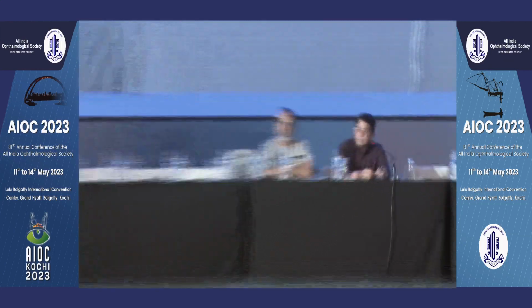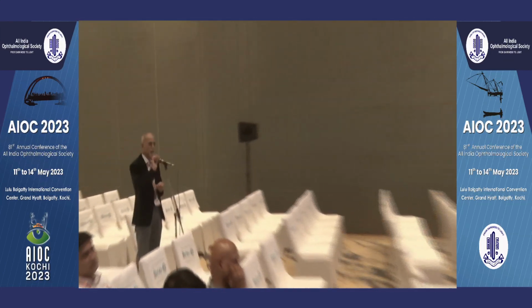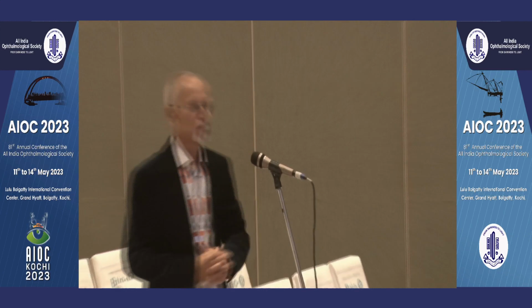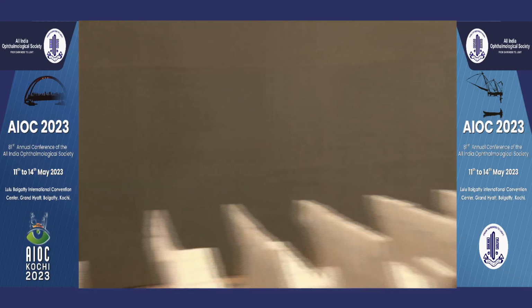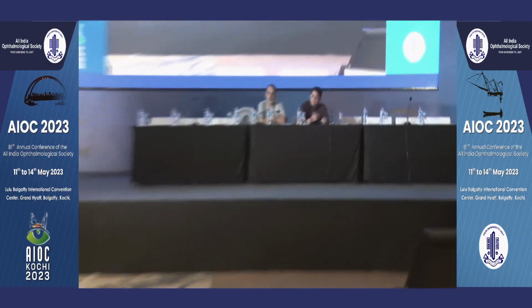Dr. Ramurthy, what has been the minimum vault that you saw in your patient and just carried on, and you're happy that the lens is sitting there in spite of absolute proximity to the lens? Absolutely. I'm going to be showing that in my presentation. We have cases with 84 microns, 100 microns vault, established, measured on the AS-OCT.